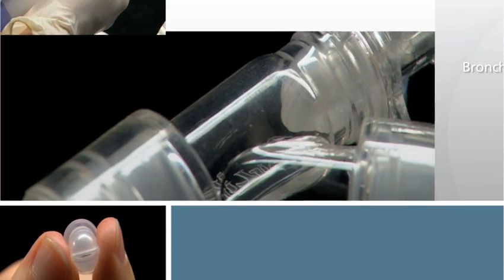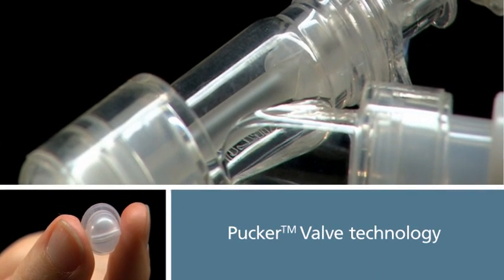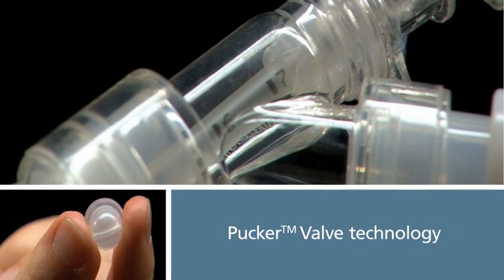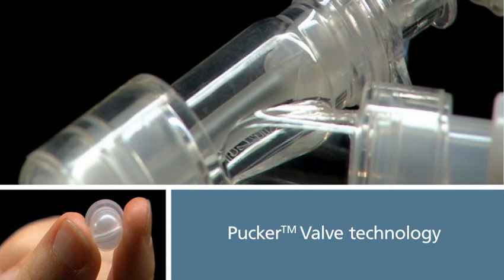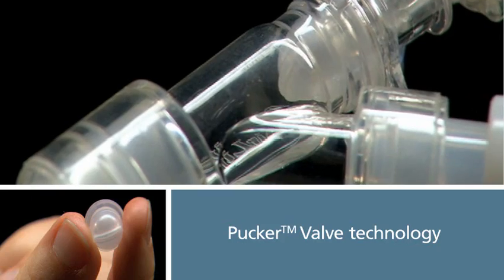This multi-access port features AIRLIFE's patent-pending Pucker Valve technology. The breakthrough design of the Pucker Valve, along with its dry-coated lubricant technology, allows for easy passage of catheters and instruments through the adapter while providing a closed circuit when not in use.